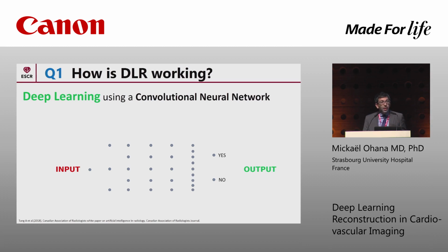And the way the algorithm connects all the layers, so the paths between all the layers, is based on the examples of the training data set that will feed the machine. So we have, for example, one input, which is a chest X-ray, and we know that the chest X-ray is normal. So we have a matched pair.